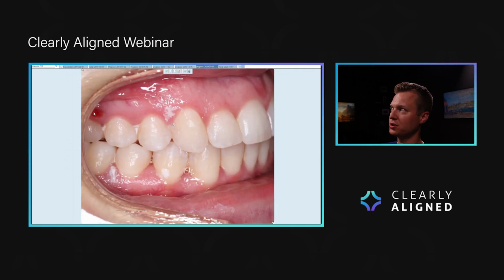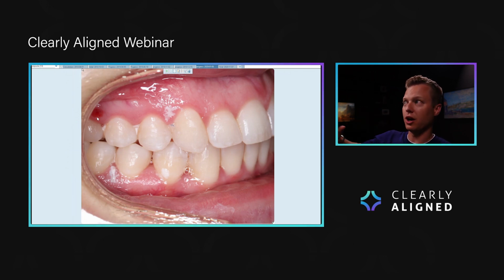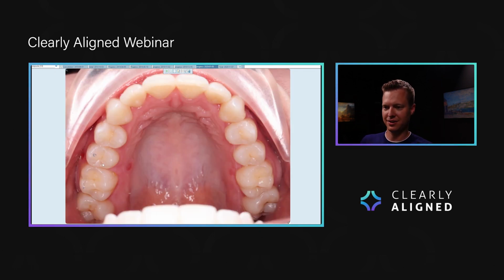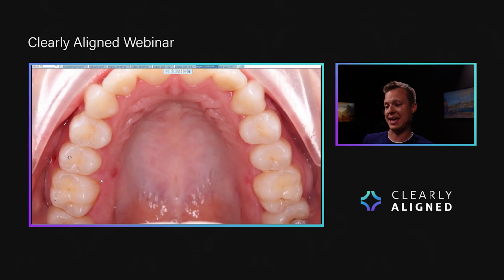Now the TAD, you can see this is where it was. This is the same day. This is like 5 minutes after the TAD came out. Literally all you're doing to take out that TAD is, I don't even use freezing because it takes more time and effort and energy and more discomfort to freeze them than literally we put sometimes some topical around it. And I just tell them, look, it's going to feel about the same as getting a needle. You untwist it, and it's super, super easy. It's super fast. Same thing on the palatal side here, no freezing or anything like that. Just literally unscrew it out, and that's that.